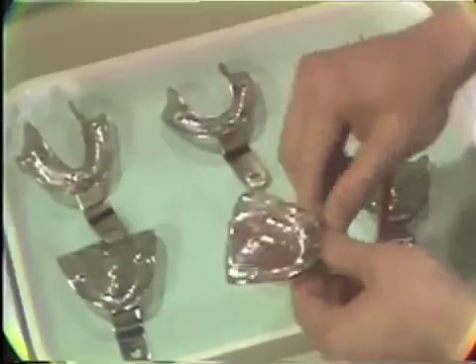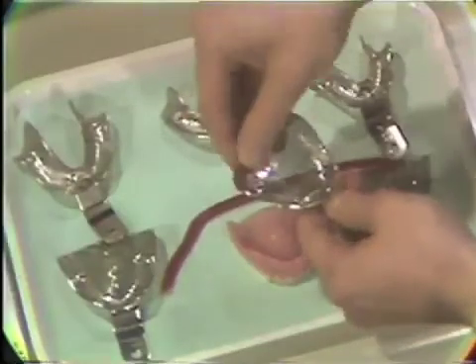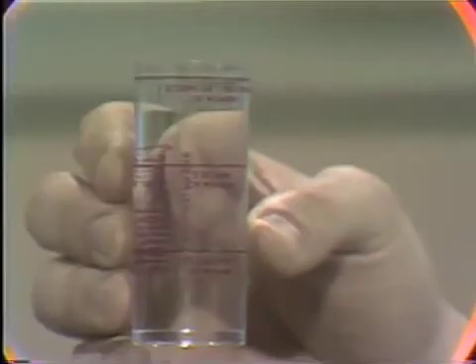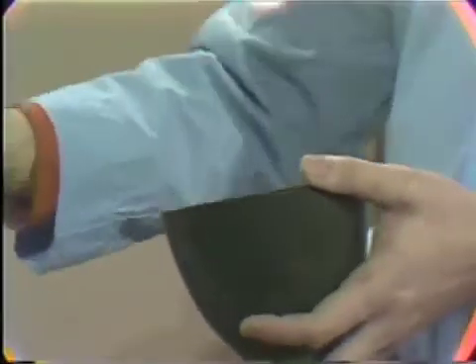The maxillary tray is being modified in the post dam area with red rope utility wax. When securing a preliminary impression in alginate of an edentulous mouth, it is advantageous to use slightly warmer water and in less amount than we would normally use for dentate patients. The differences in water temperature and water-powder ratio will result in a stiffer mix that will set faster. The stiff material will better record the peripheries and soft tissue anatomical landmarks necessary for the impression.